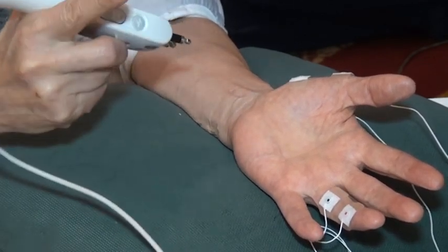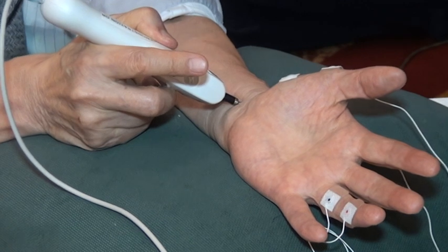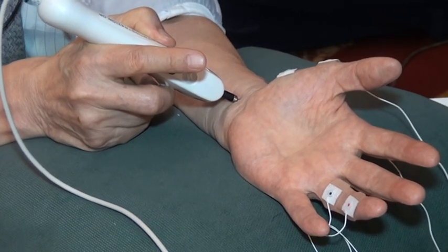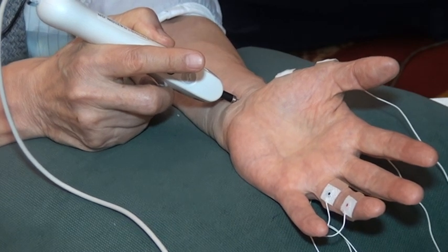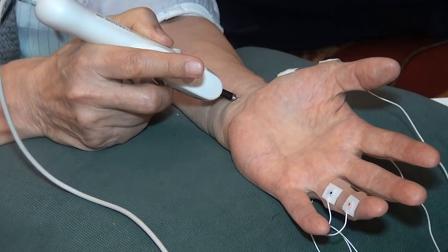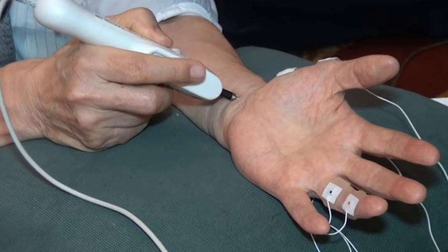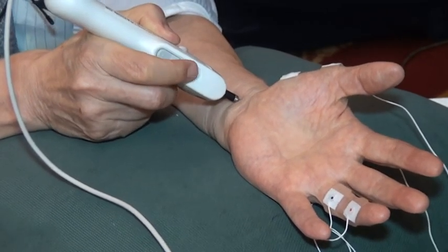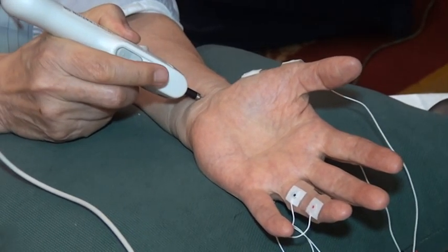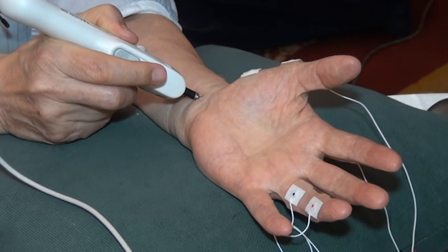That intensity is called maximum intensity. And we usually use 20% supramaximal, meaning we add about 20%, just to make sure that you stimulate everything. This is 20% supramaximal, because if I increase the intensity more, it doesn't change. And this is what you take.